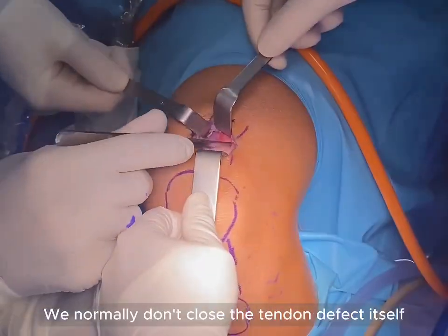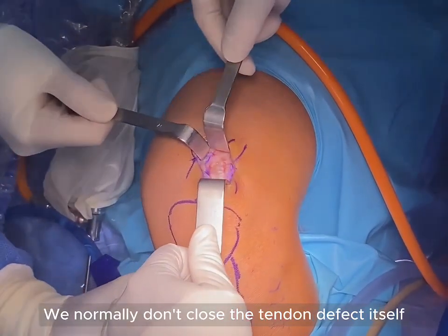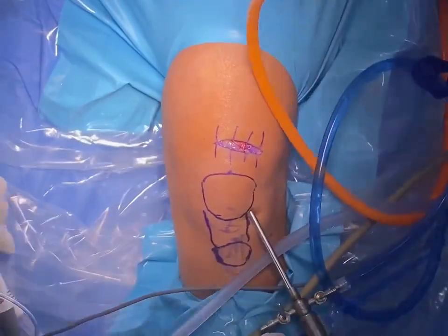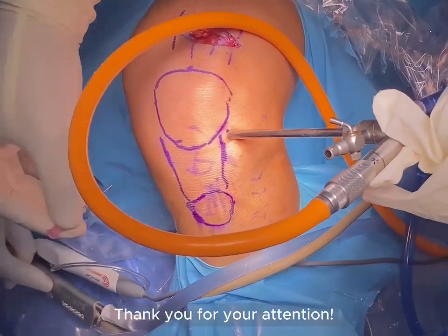We normally don't close the tendon defect itself and finish skin closure in the standard fashion. Thank you for your attention.